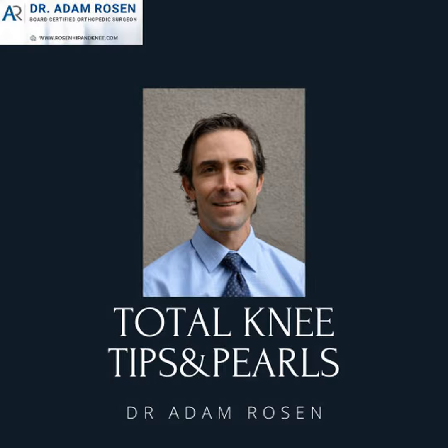So the approach in a virgin knee for a primary total knee replacement is a little bit more straightforward because it's healthy tissue. It hasn't been distorted. And if a knee's been in there for a while, due to scar tissue, prior surgery, if they've had an infection, if there's synovitis, if there's other issues going on, it's not straightforward getting in there.